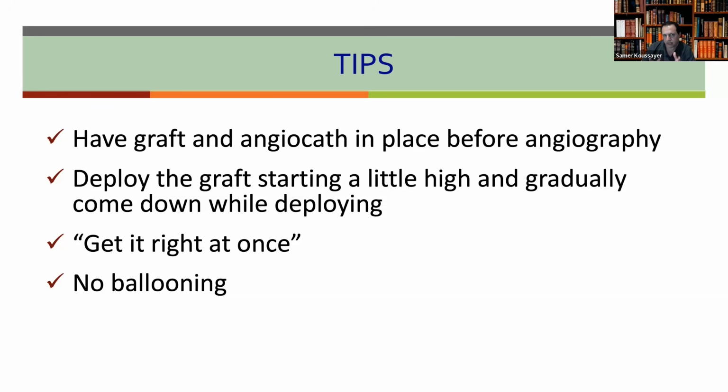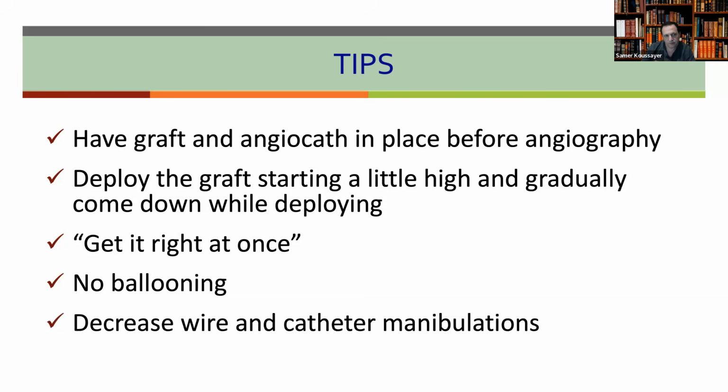So when you deploy, you do an angiogram. If you're happy, stop. Don't do ballooning. If you see a type 1 endoleak, you have to be very gentle with the ballooning. And again, decrease wire and catheter manipulations.